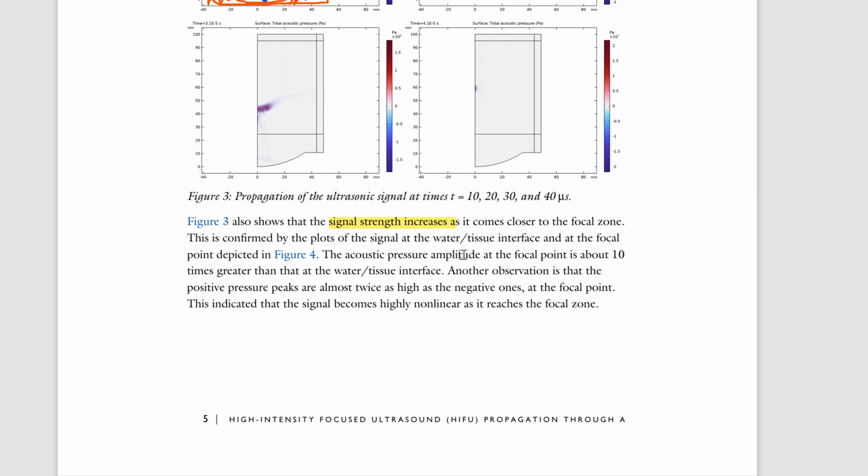The acoustic pressure amplitude at the focal point is about 10 times greater than that of the water tissue interface. Another observation is that the positive pressure peaks are almost twice as high as the negative ones at the focal point. This indicates that the signal becomes highly nonlinear as it reaches the focal zone. Oh, highly nonlinear as it reaches the focal zone.